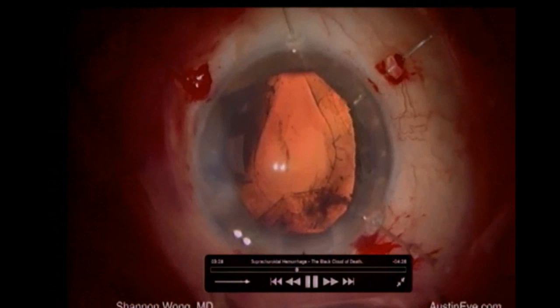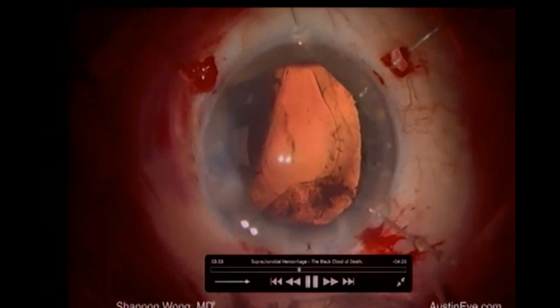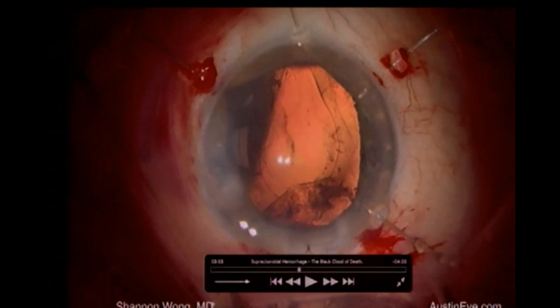You see there's a shadow that's starting to appear from here. Let's suppose, God forbid, you saw something like that inside surgery. What will you do? Call your attending. Immediately attempt to close, as you mentioned, the eye. And before that, you can also check the patient's blood pressure, ask the anesthetist with you to lower the patient's blood pressure if it's high, give some mannitol if possible, and immediately close the eye. And this is what the surgeon is going to do.